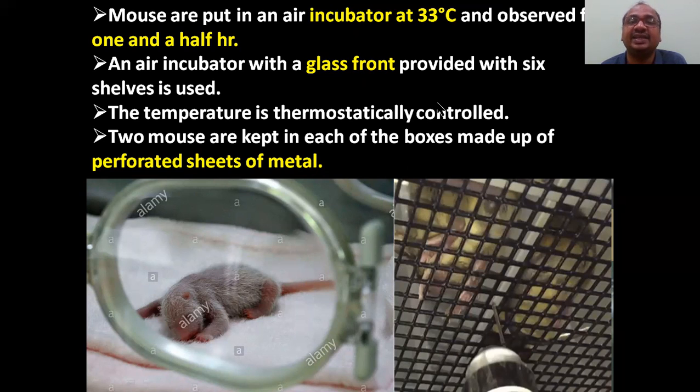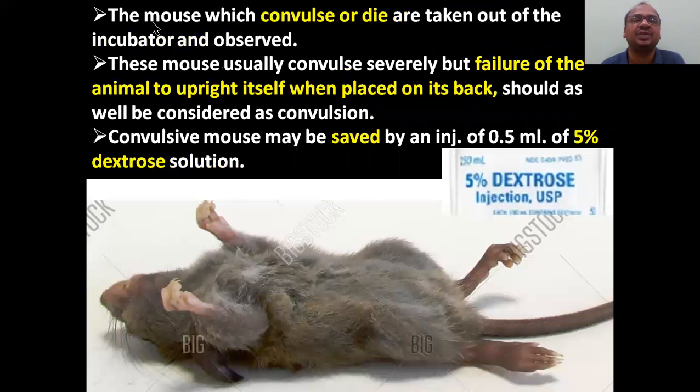Okay, so that 33 degrees can be maintained exactly, and the glass window allows visibility. Whether convulsions are there or not, you can find easily. The mice, either it has died or it is under convulsion, that you have to take as a convulsion mice, convulsion rat only, like that you have to consider.